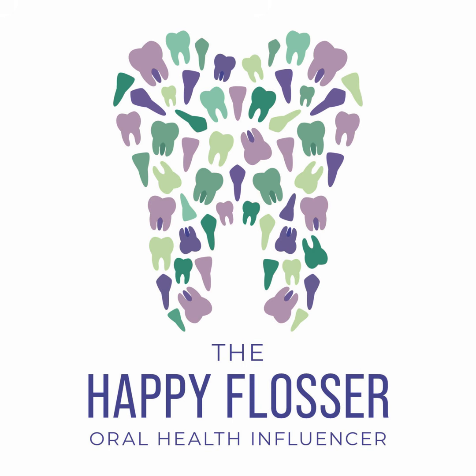So sometimes a malignant lesion usually destroys the cortical bone in its path, causing little cortical expansion. Sometimes the periosteum is carried along with the tumor and continues to lay down bone in what we call a sunburst pattern. So that's something that would be kind of a standout to you if you see that in your patient. It almost looks like a sunburst, just a star.